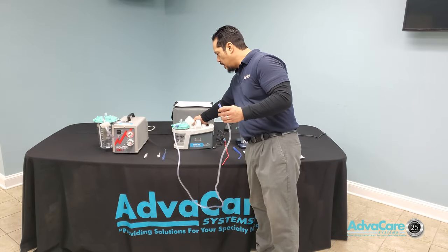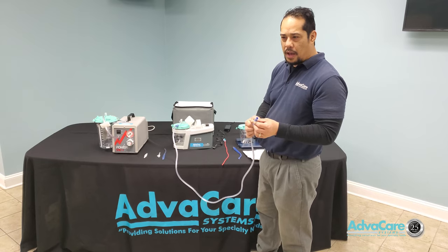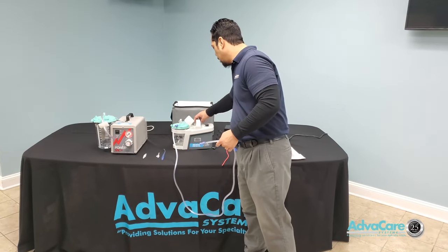Once you have all connections made, power on and be able to apply any type of suction therapy needed to adequately clear any type of fluid buildup.